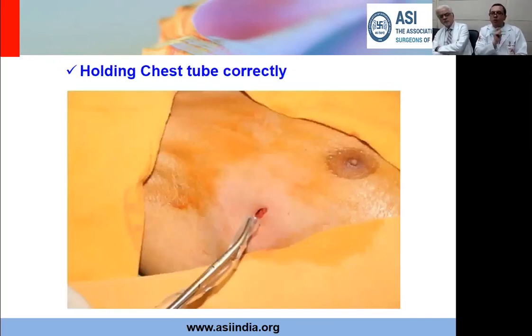The next step is how to hold the tube correctly, having made the hole and asked the patient to stop breathing. As you would see here, the artery forceps or the Kelly's, which I'm using, is not protruding beyond the chest tube. It's just stopping a few millimeters short of the chest tube. So it will act as a trocar to put the chest tube, but at the same time, on the inside, if by chance the lung was to be hit, what will hit the lung is the chest tube and not the artery forceps. So it's important that you hold it in such a way that your artery forceps is a few millimeters before the end of the chest tube, and the chest tube end is protruding.